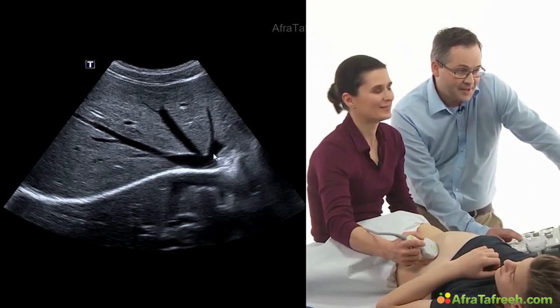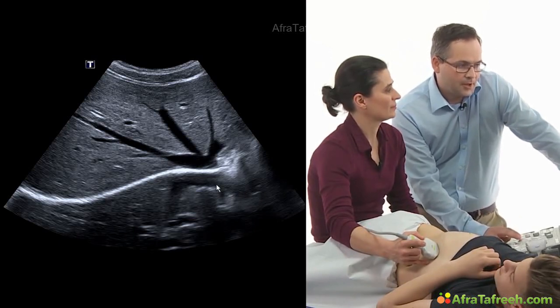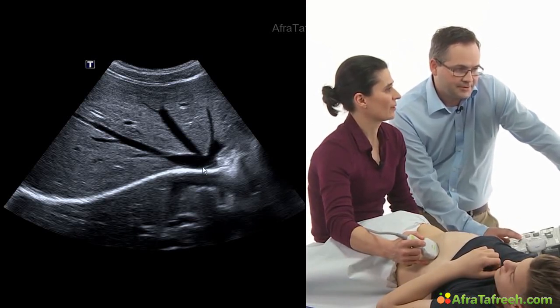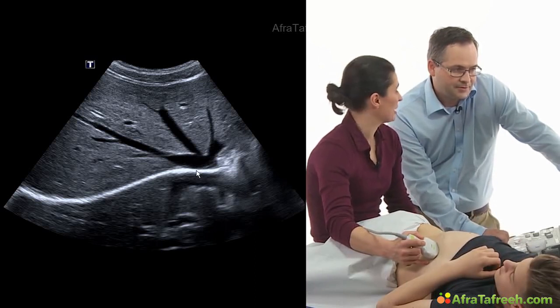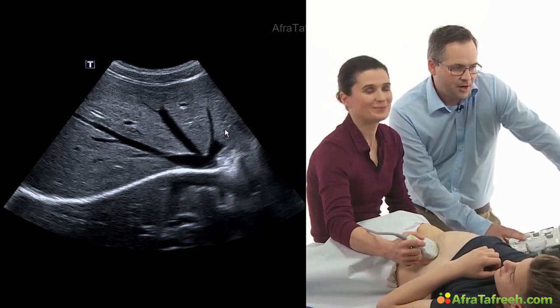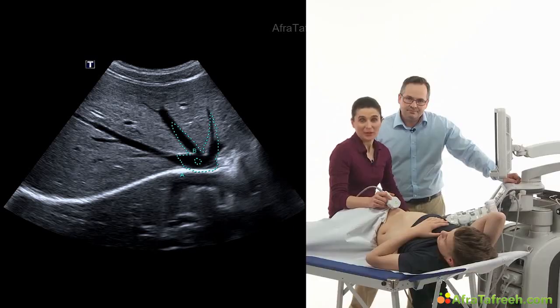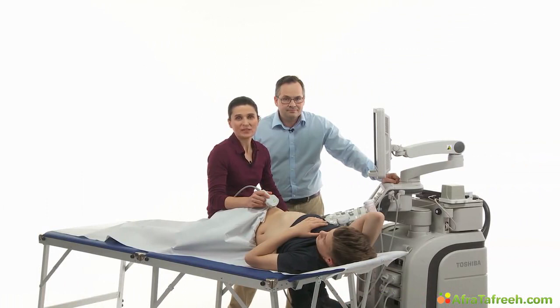It is. There are 3 liver veins, the left one, the middle one, and the right one, and the confluence to the vena cava inferior over here. And somehow it looks a little bit like a bunny to me. Yes, you are correct. Some say it looks like a star, the star of the liver veins, but it's a bunny. And actually, the more it looks like a bunny, the higher the likelihood for liver congestion. But this we will discuss in our chapter of liver pathologies.